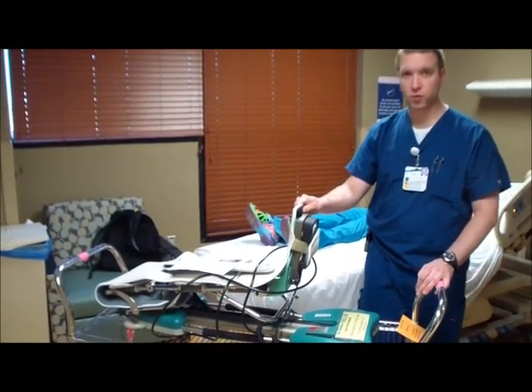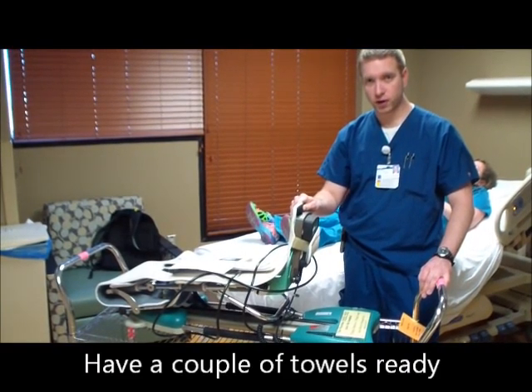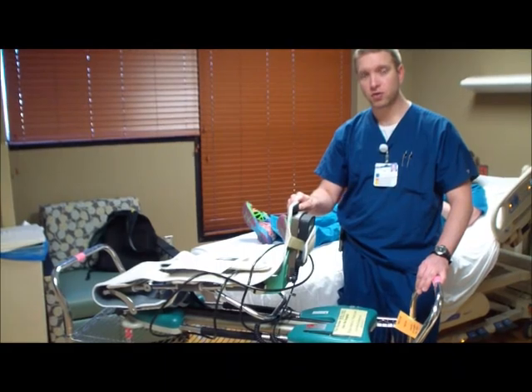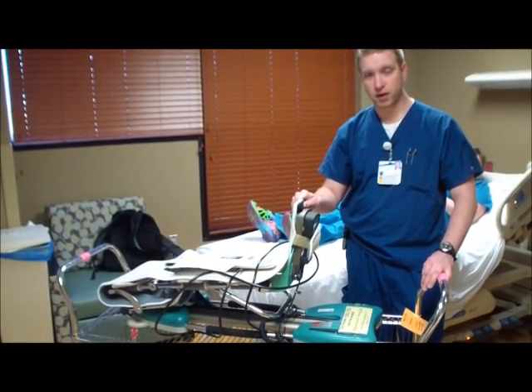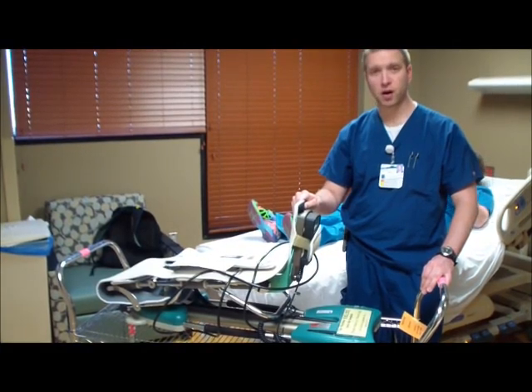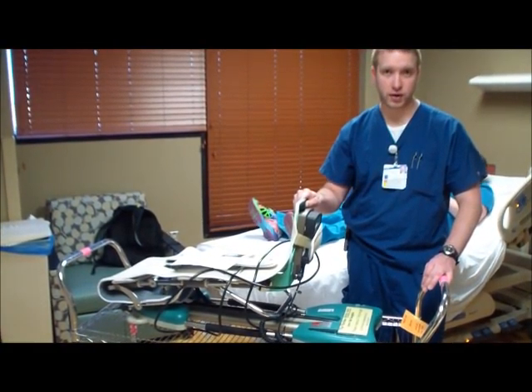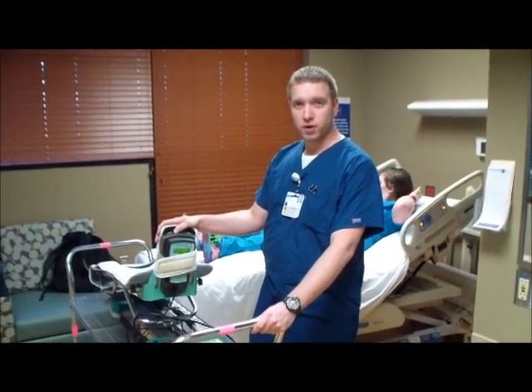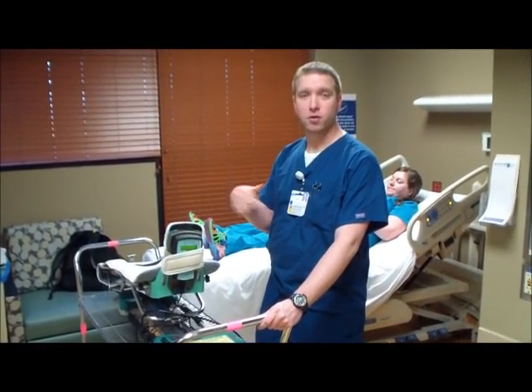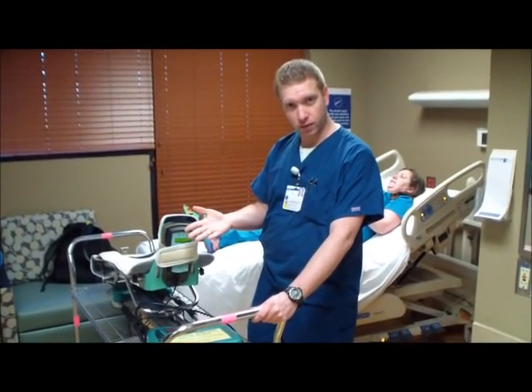Probably what you'll want to do as well is get a couple of regular towels, as well as some blankets to help secure the CPM in place. This also helps to cover some areas to make sure there's no skin breakdown that occurs. So once you arrive at bedside, you want to introduce yourself to the patient. Hello, my name is, insert your name here.